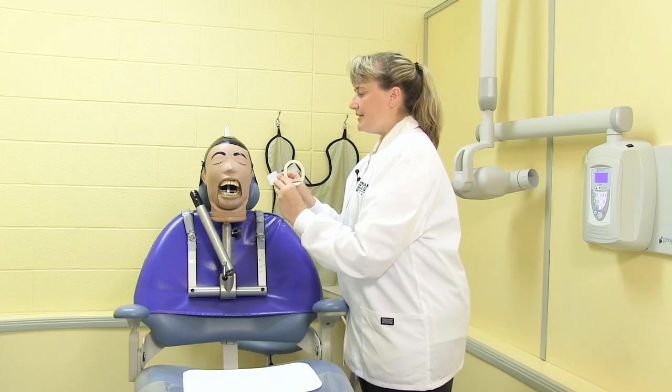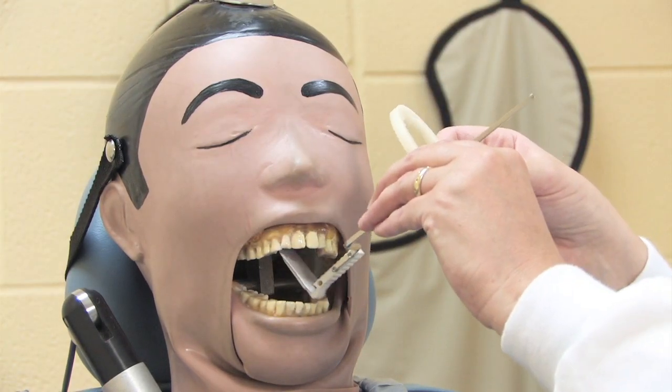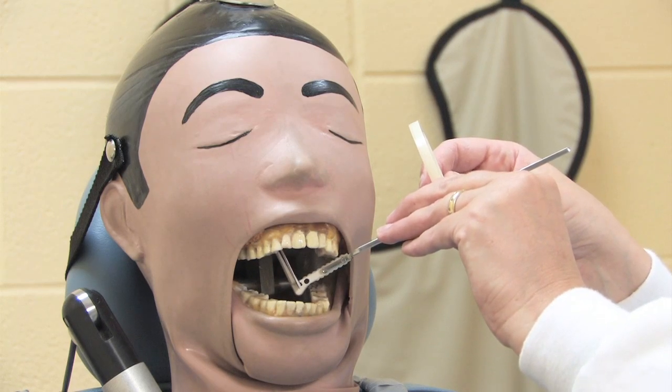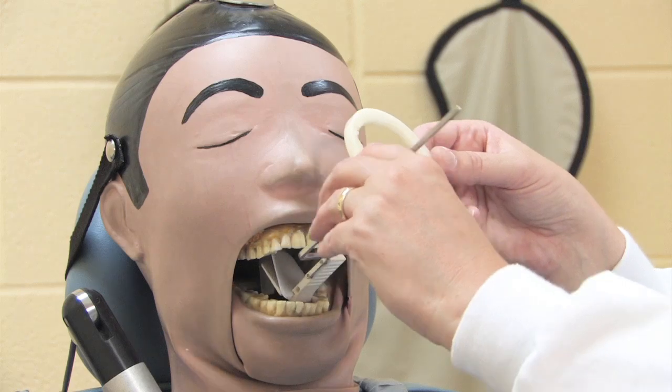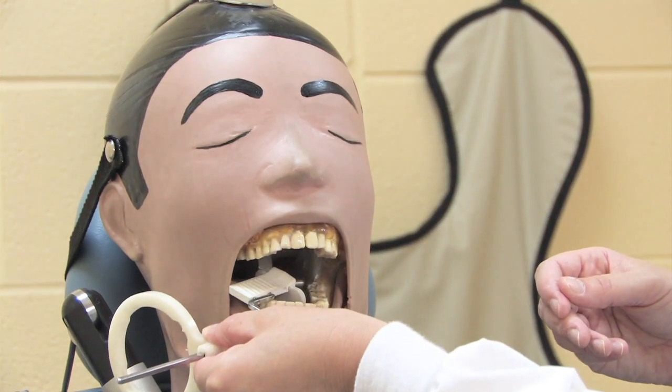With this instrument set up, I'm ready to do either the second quadrant or the upper left for the client. I'm also ready to do the lower right or the 4th quadrant.